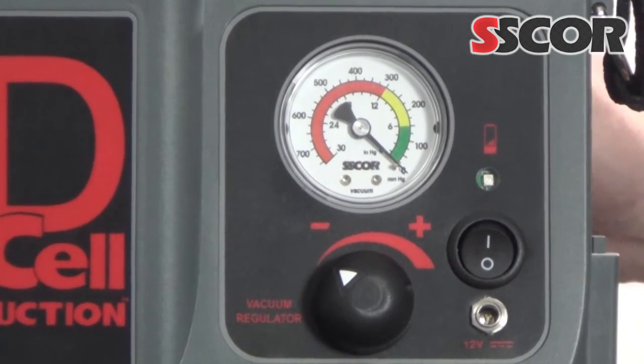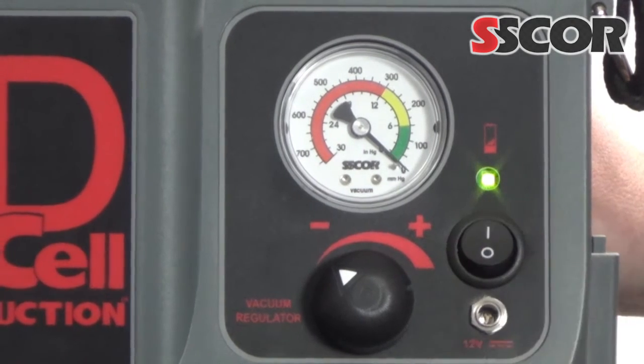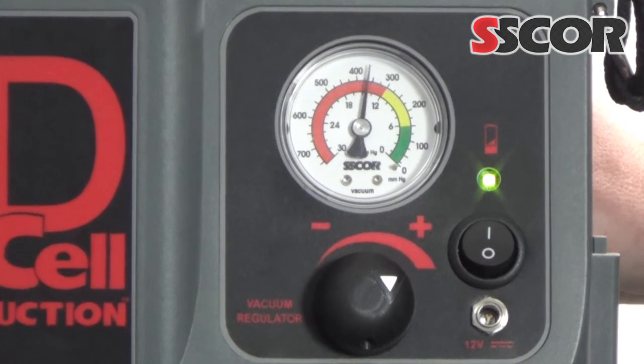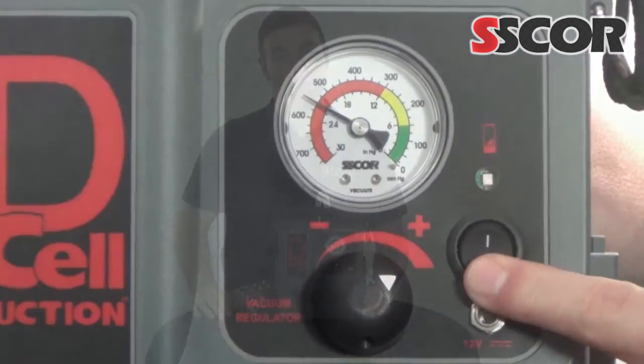To adjust the vacuum level, occlude the patient tube and turn the vacuum regulator clockwise. Watch as the gauge rises to negative 300 millimeters mercury from 0 in 3 seconds. It should max out at approximately greater than or equal to negative 525 millimeters mercury.